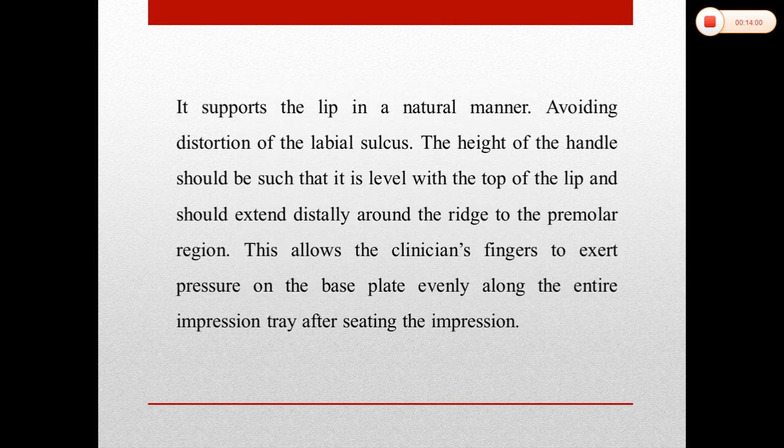So what is this intraoral handle? An intraoral handle is a handle which spreads from one premolar area to the other premolar area. That means from one buccal frenum to the other buccal frenum, and the height of the handle should be at least at the level of the lip. This allows the clinician's fingers to exert an equal amount of pressure on the special tray while making any impression.